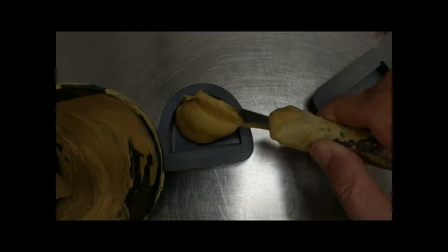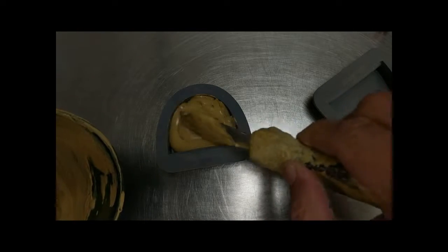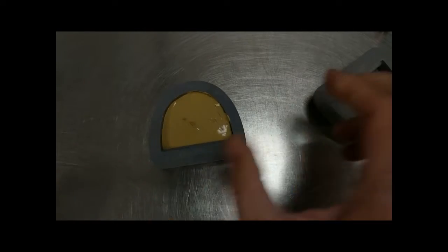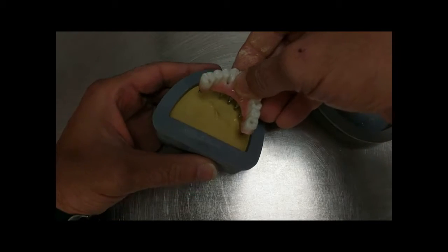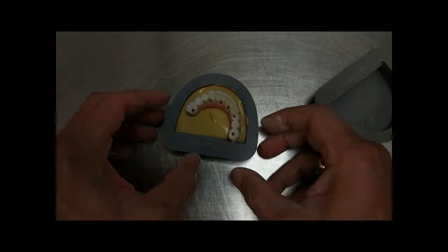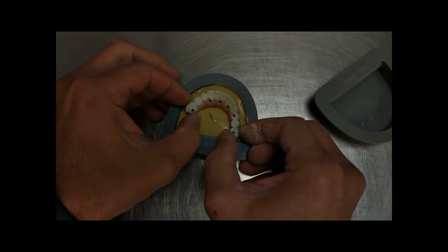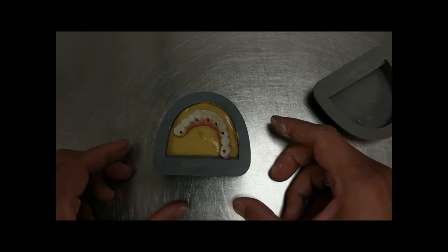The next step is to fill one side of the flask with stone. It is very important that the stone only comes to the top of the analogs. You do not want to have the prosthetic dropped down into the stone because it could get locked in. The prosthetic was adjusted and rotated slightly, not shown in this video.